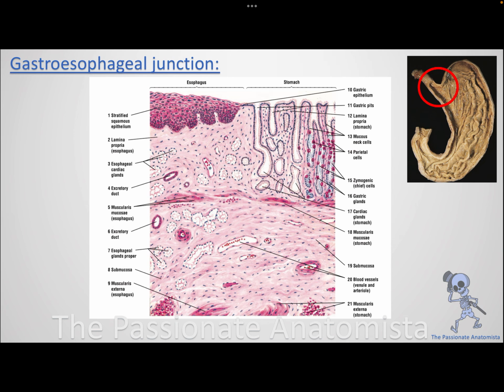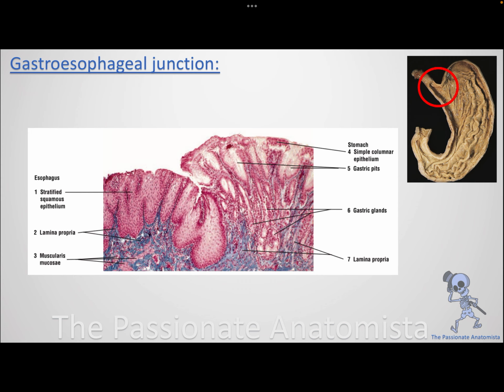Okay, this is general talking. Let's proceed and see what happens in the stomach. And this is another histological picture with a special stain.